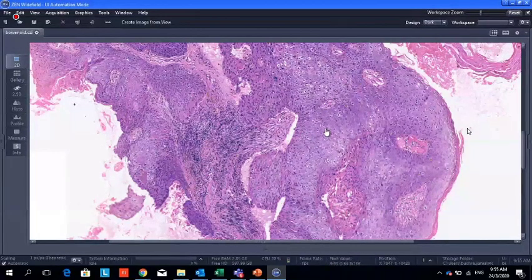We call it neoplastic, okay? We cannot say benign, because benign is different. Benign cannot progress, because we have mild, moderate, and severe changes.